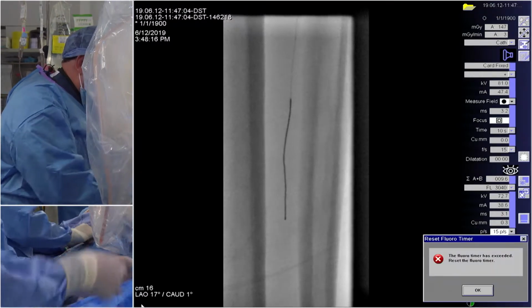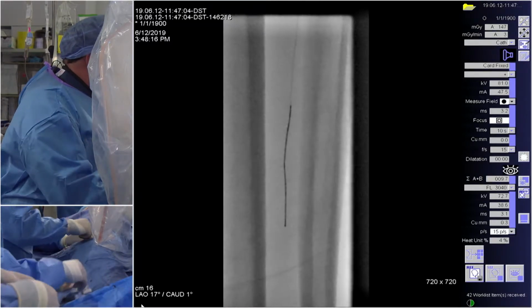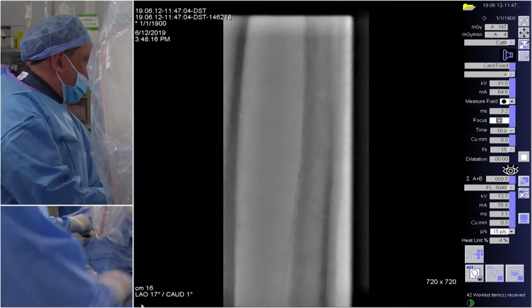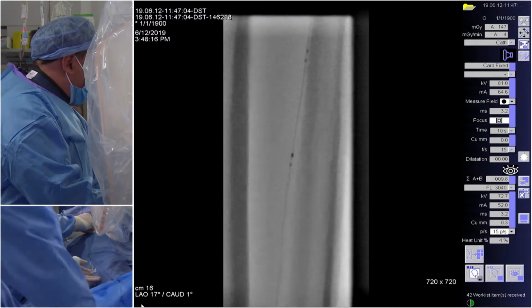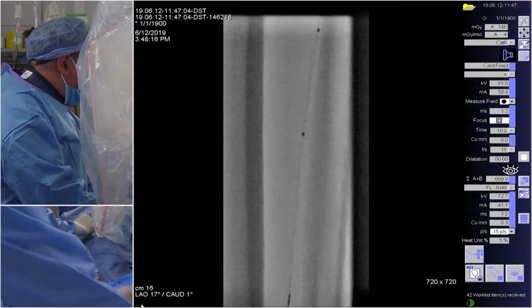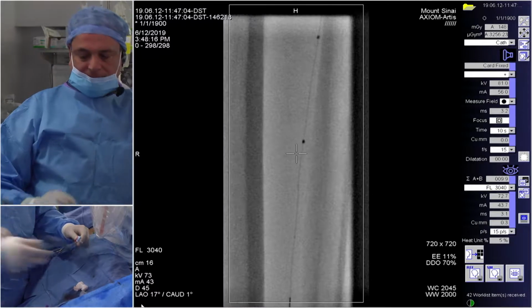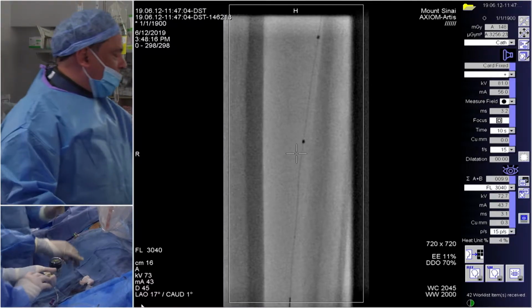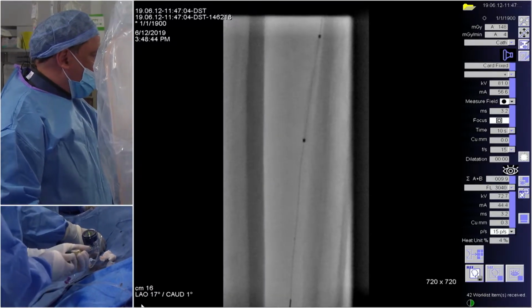Do you do a lot, Chris? Yeah, you individualize. Sometimes in Tennessee, just like in New York, you get pretty big panus, so that makes it hard. But if you don't have the panus and you don't have disease in the proximal or ostial SFA, the more distal in the foot that we have to go, the more I'd want to go antegrade, so that I could make sure I could reach with anything, not just one balloon, but maybe a stent or anything else.